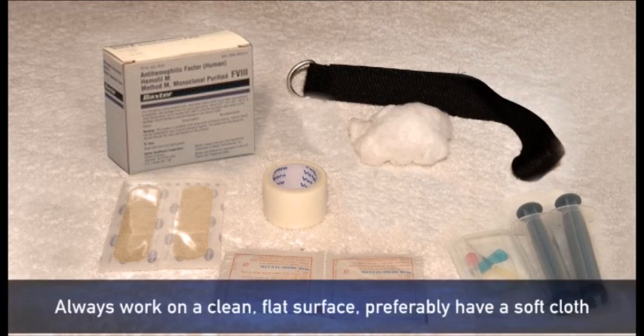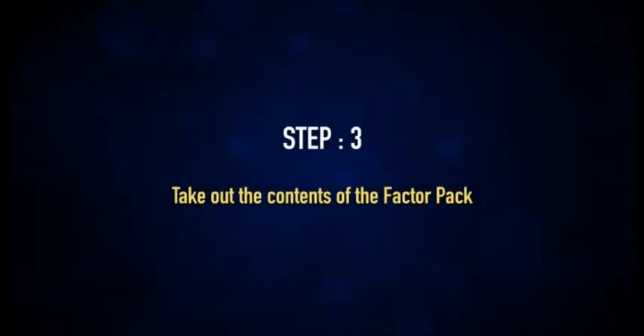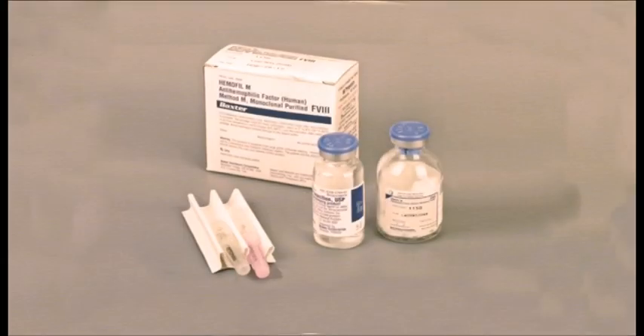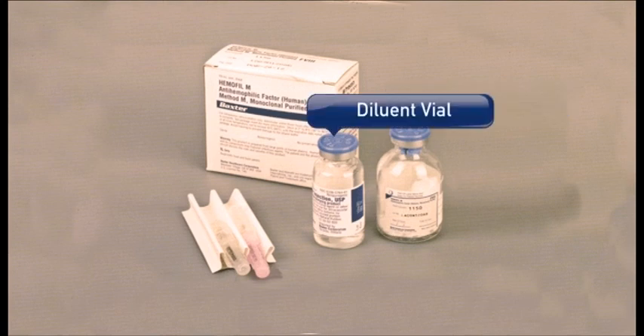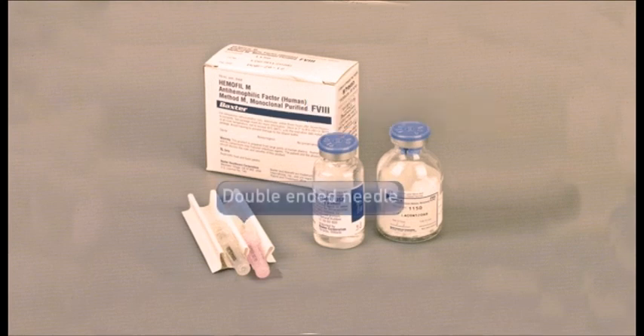Always work on a clean flat surface, preferably with a soft cloth. Take the contents of the factor pack out. It should have a vial with powder (factor vial), a vial with solution (diluent vial), a double-ended needle, and a filter needle.